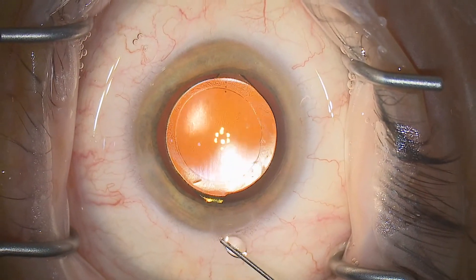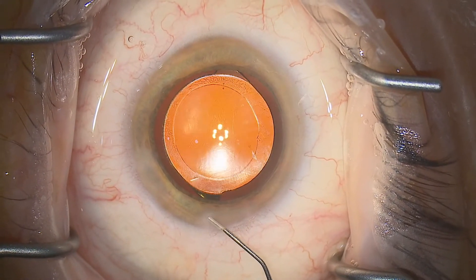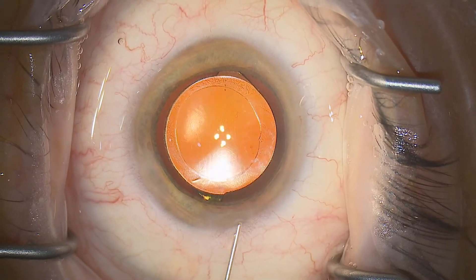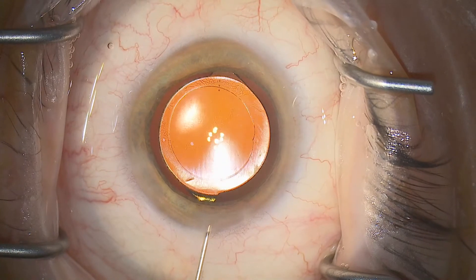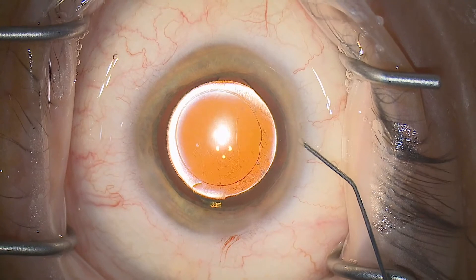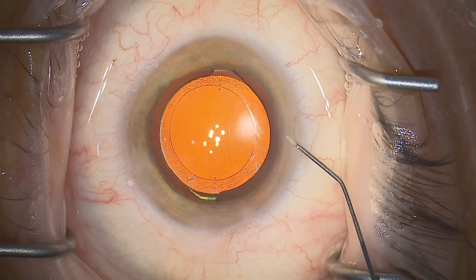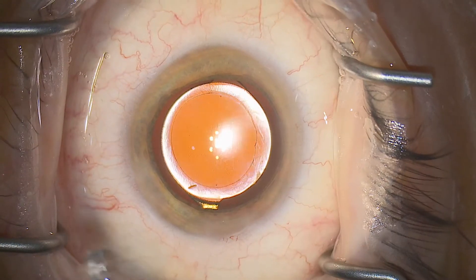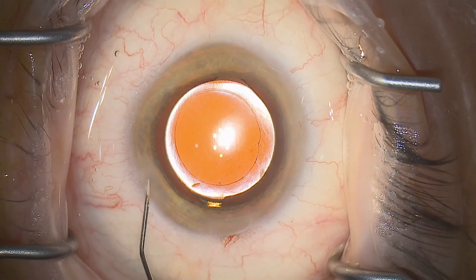A little bit of judicious entry site hydration here. Remember, the time to do your checks is on the table, so that if there's a problem with the entry sites and their sealing function, you can fix it there. 2% fluorescein is very useful if you're ever unsure about whether or not you have a leak. And a very key point: if you think about putting a suture in, you should probably do it.